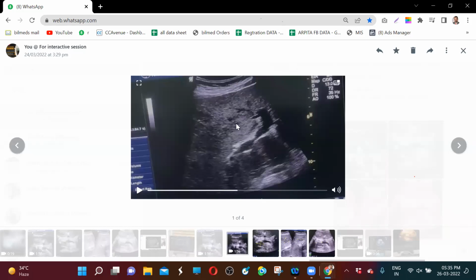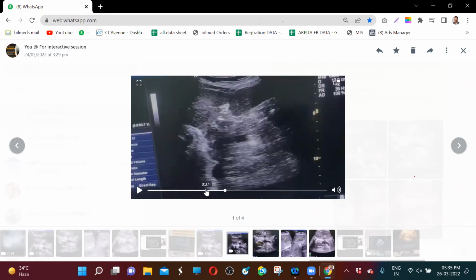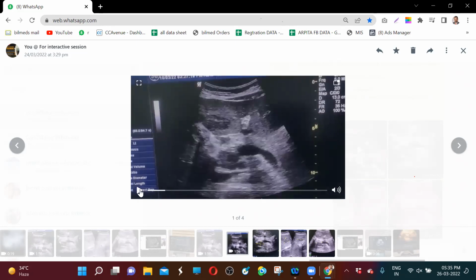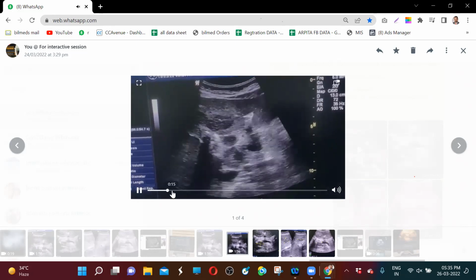So point number two, it is in the deeper level of the liver because I am right now cutting through the portal vein. So this area is very favorite for fatty infiltration or fatty sparing. So this can be a focal spared area, but don't straightaway jump onto that. Now, if this is a suspected case, maybe a malignant case, are you thinking on those lines? Yes, but my first suspicion was focal sparing only.